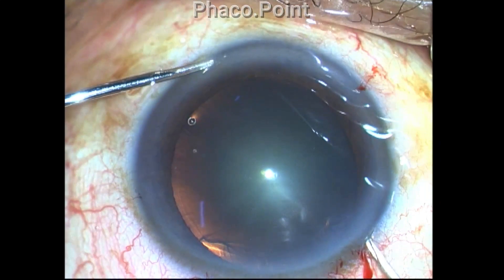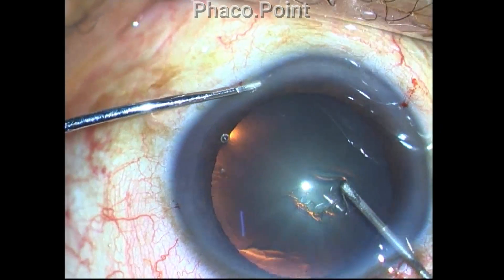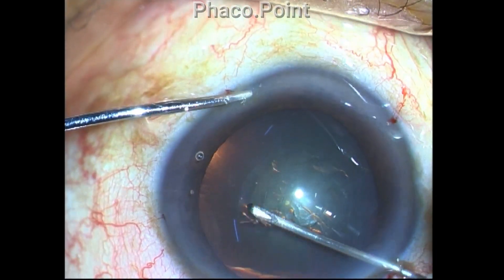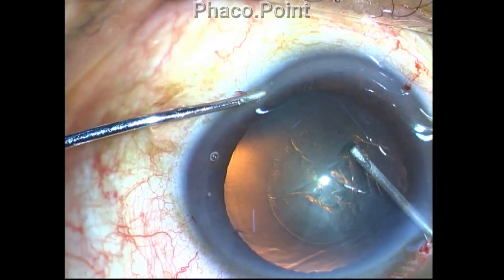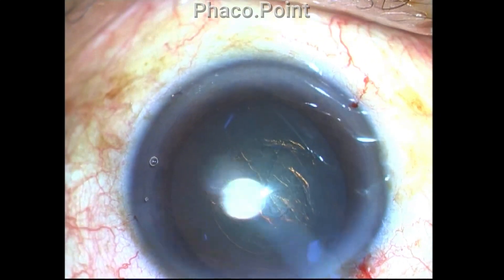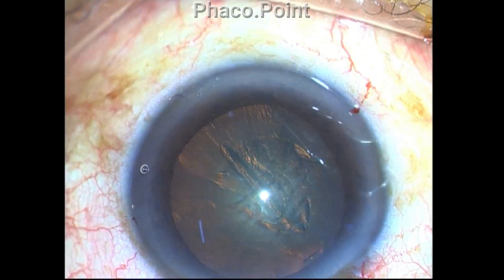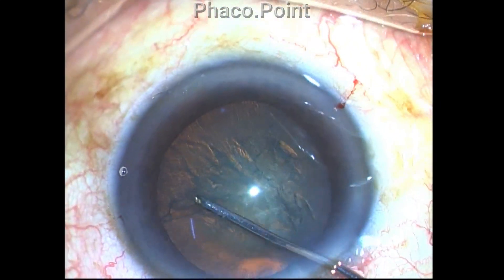The procedure was done under topical anesthesia. While performing the capsulorhexis, I take due precaution to make sure that there is good centration and sizing of the capsulorhexis to about 5 to 5.25 millimeters. Following which, an adequate and careful cortical cleavage hydrodissection is performed in order to cleave all the cortical capsular adhesions and make sure that the lens will rotate.